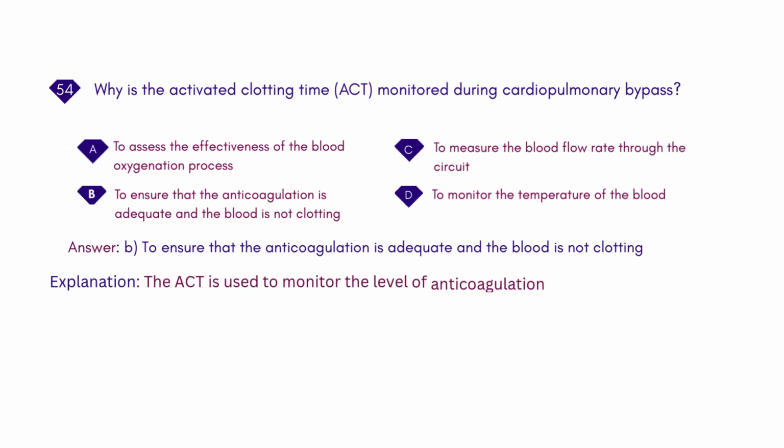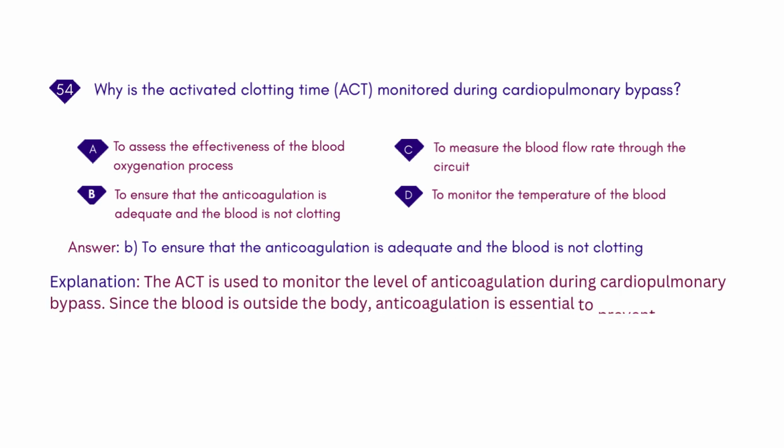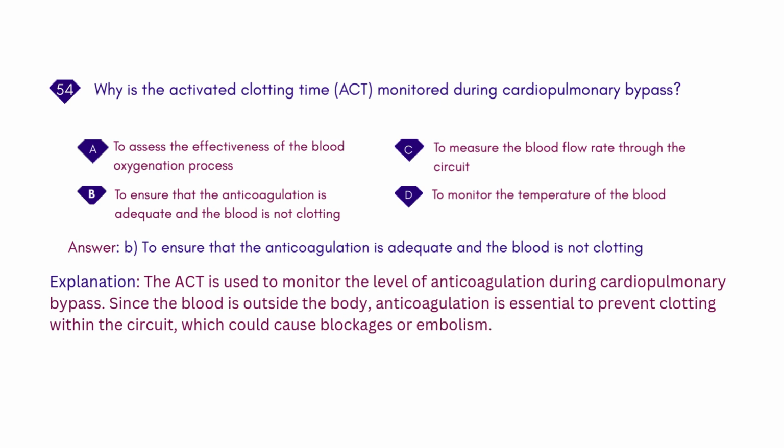Explanation: the ACT is used to monitor the level of anticoagulation during cardiopulmonary bypass. Since the blood is outside the body, anticoagulation is essential to prevent clotting within the circuit, which could cause blockages or embolism.